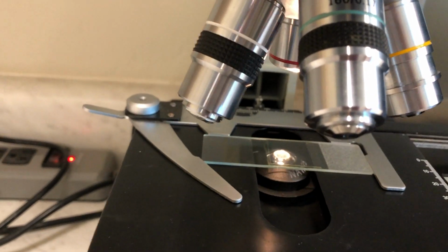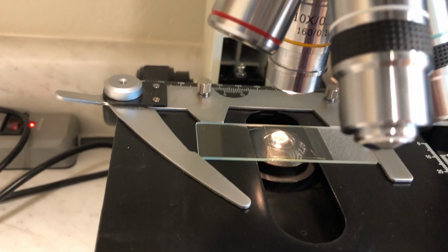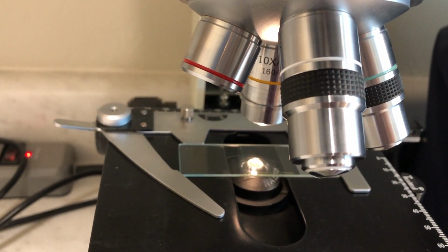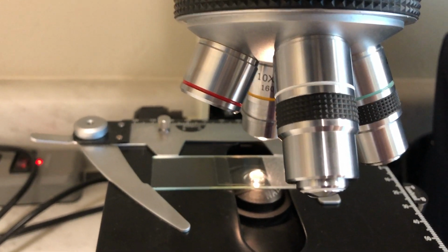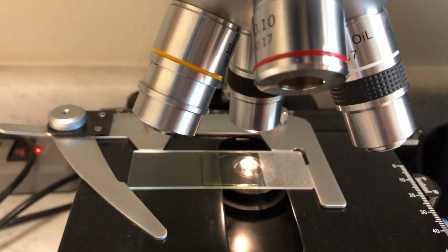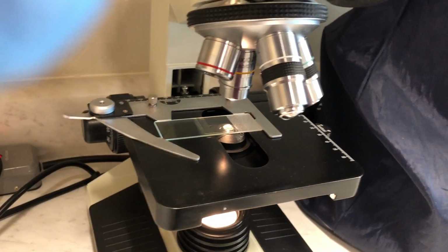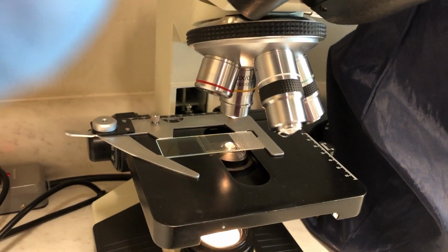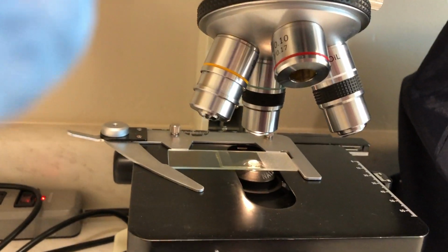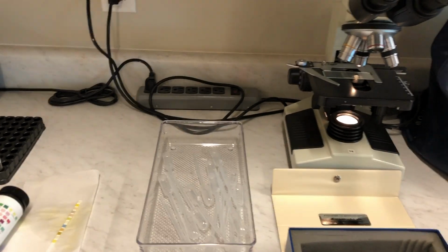So to evaluate it, you're going to evaluate it on low power, which I like to use the 10, and you're going to focus and scan the entire area under the cover slip in a serpentine pattern. And then once you've done that, you're going to go to the 40x, which is high power, and do the same thing. The 10x, the low power, is going to be ideal for seeing large things like casts and crystals. And the 40x, the high power, is going to be ideal for identifying cells and bacteria. And that's how you run a urinalysis.